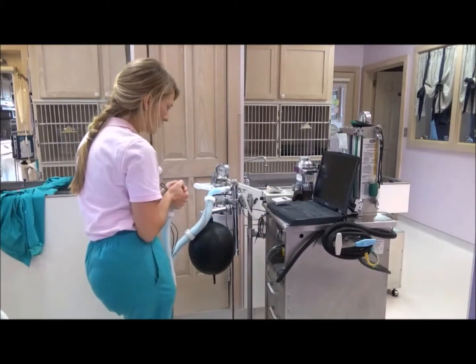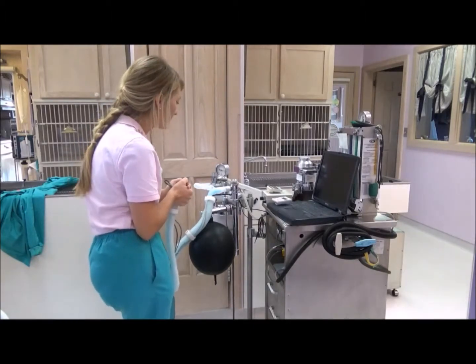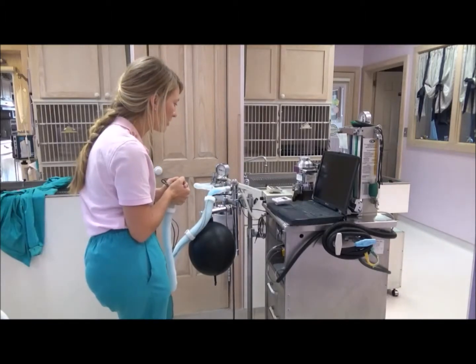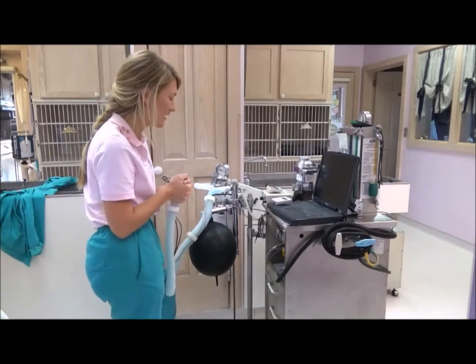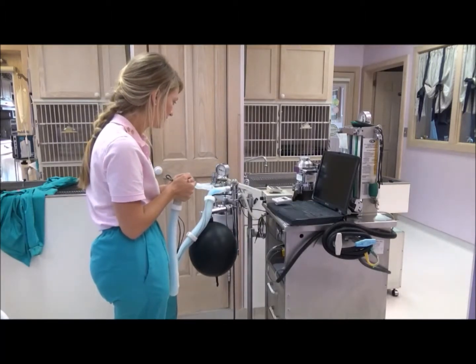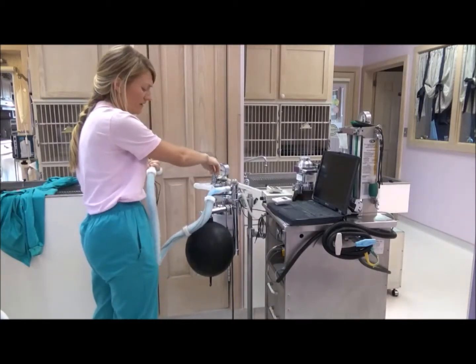And it's reached 30, so now I wait for about 10 seconds. And I just want to make sure that the pressure isn't dropping. Really, you shouldn't drop any at all from the 30 mark. If it does, then that's when you want to start assessing possible leaks in the machine. Looks good. So I'll go ahead and I'll let off.